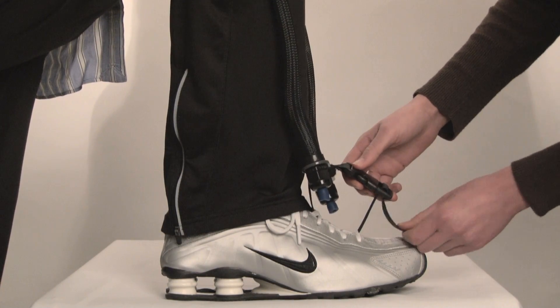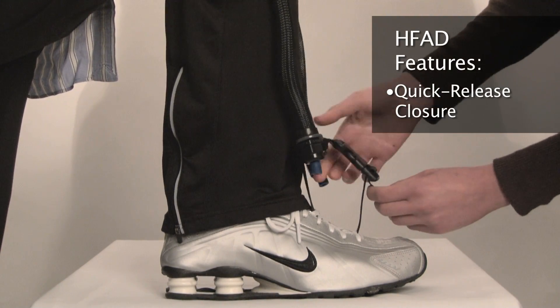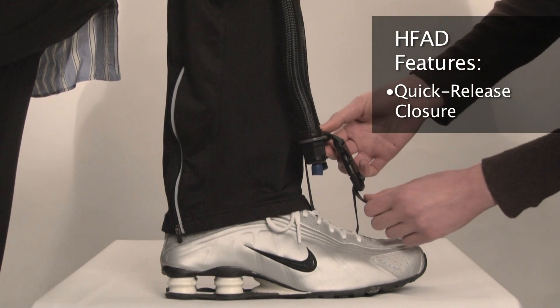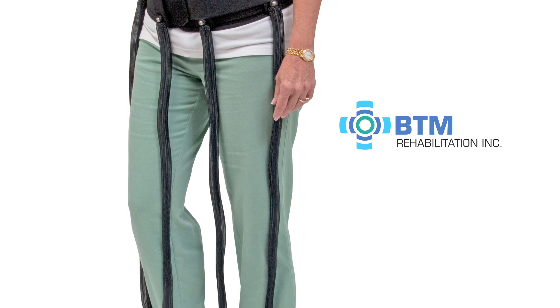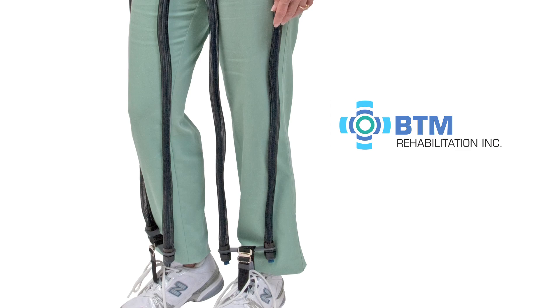The level of assist can be customized by tightening or loosening the quick-release closure, or when necessary by lengthening or shortening the dynamic tension bands. The HFAD can also be configured bilaterally for patients who are experiencing hip flexor weakness in both legs.